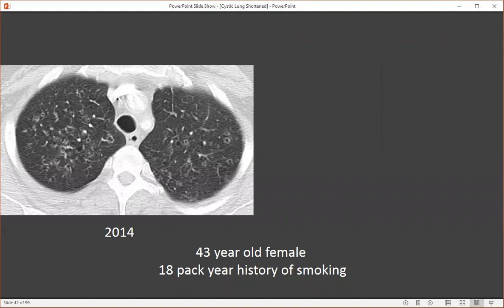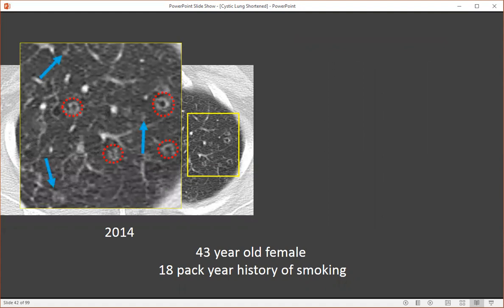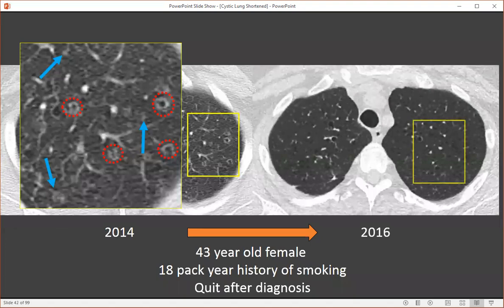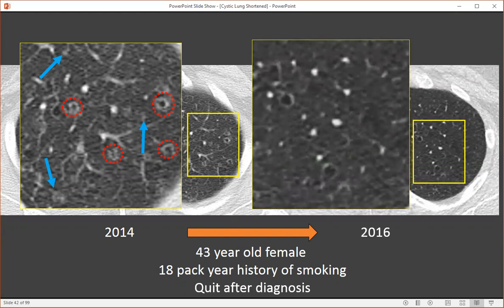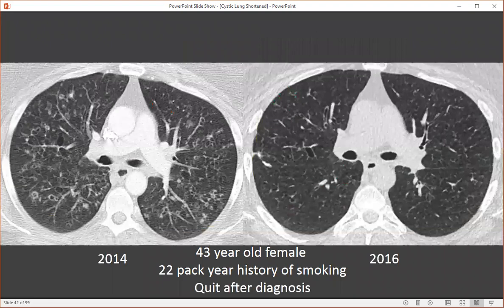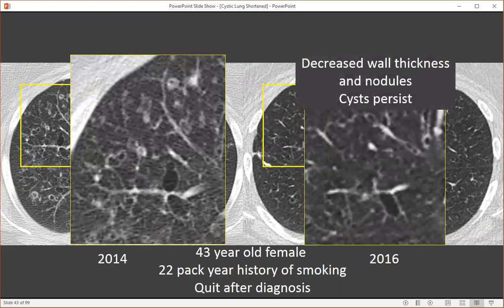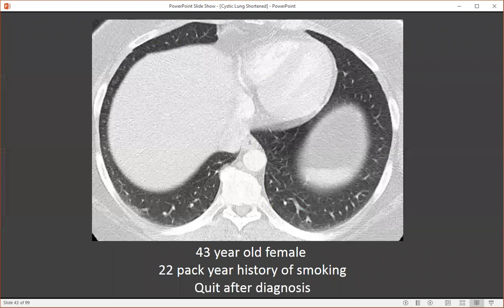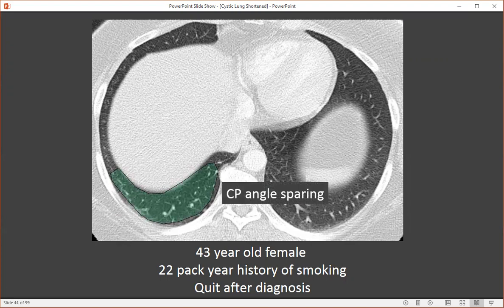Here's a 43-year-old female with an 18-pack-year history of smoking. In 2014, she has thin and thick-walled cysts in her upper lung zones as well as small nodules, characteristic of PLCH. This person quit after diagnosis in 2016, and we see that the nodules and thicker-walled cysts subsequently resolved, though she was left with residual cysts. This is characteristic of PLCH — if they stop smoking, the disease can certainly improve; however, the cysts are permanent and do remain. We can see just how extensive her disease was, with numerous solid and subsolid nodules and cystic change. The cysts persist, but nodules and cavities improve after smoking cessation. No matter how severe the disease, the costophrenic angles are almost always spared.